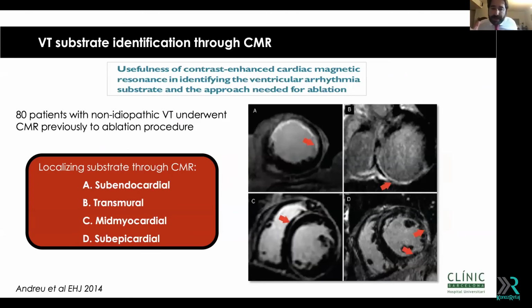And just by using MRI, even with this new software that we will be talking about, you can already know if the substrate is endocardium, like in figure A, or transmural, like in this example, or midmural in this example, or epicardial in this example.